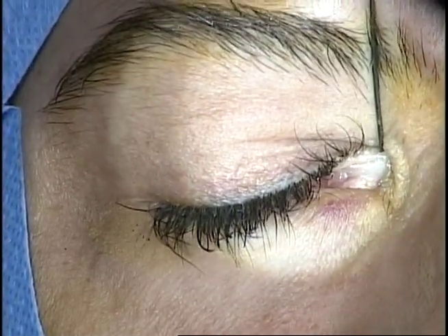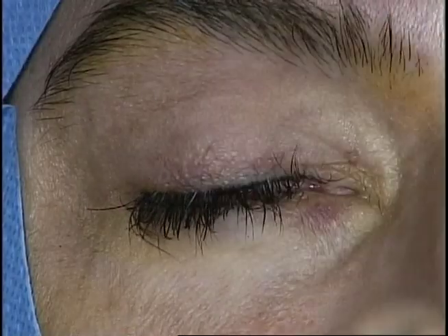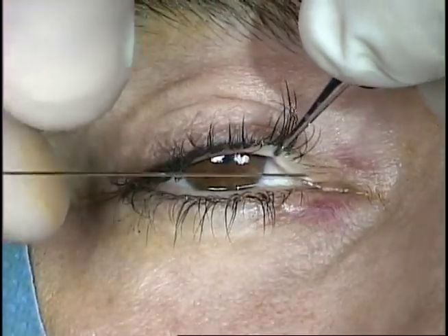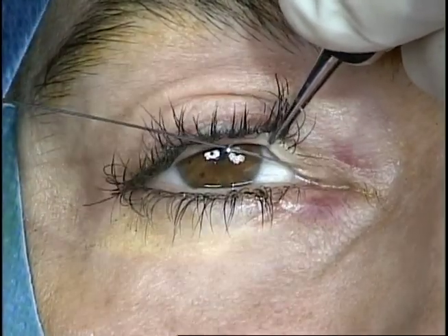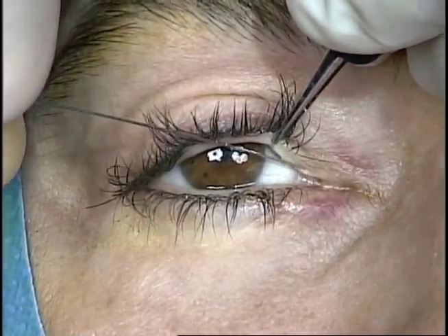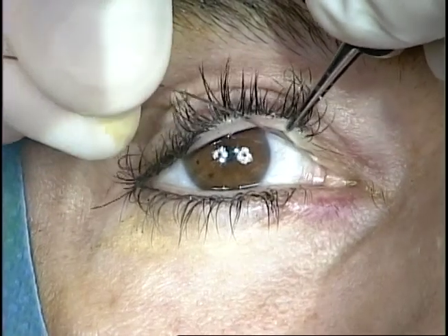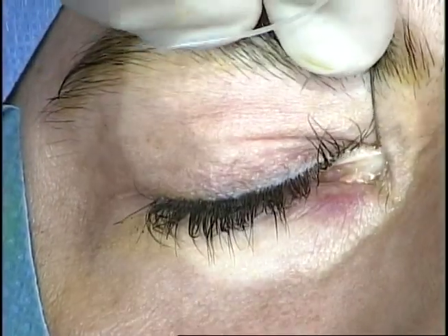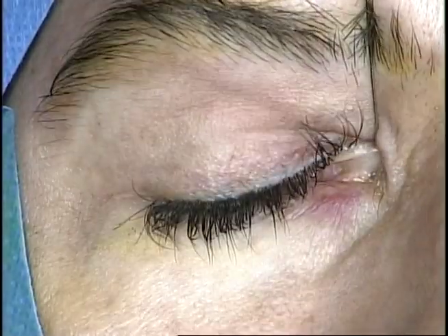The probe is then placed down the nasolacrimal duct. A Crawford stent is then introduced in the same manner as the Bowman probe. The stent is then rotated down the nasolacrimal duct and will be retrieved from under the inferior turbinate with a Crawford hook.